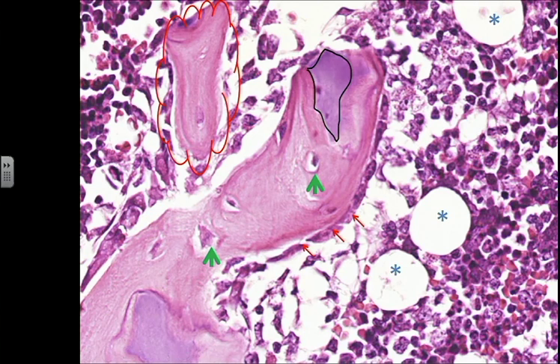Again, to summarize, this image was showing a section from bone. The type of bone is trabecular or spongy or cancellous bone. They all have the same meaning. It's in a child. The clue to identify that this is bone is the pink matrix, the homogeneous pink staining, which characterizes the bone. There are cells inside the bone matrix, and there are cells just at the edge of the bone.